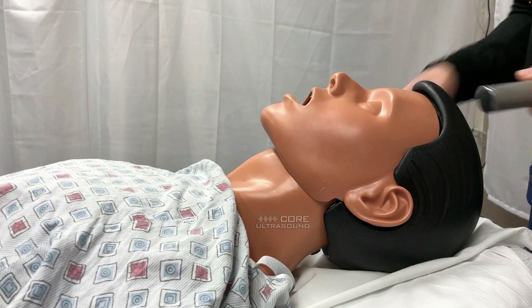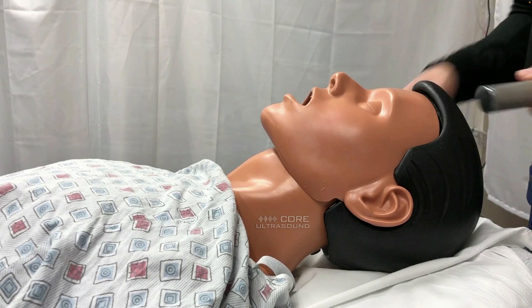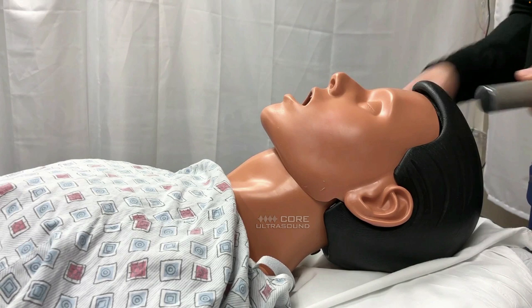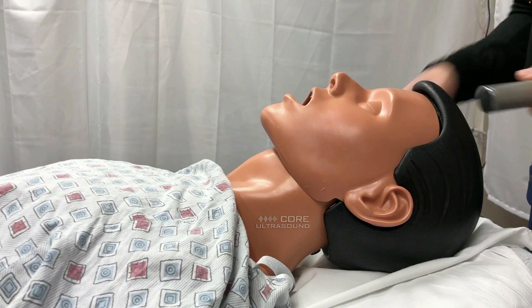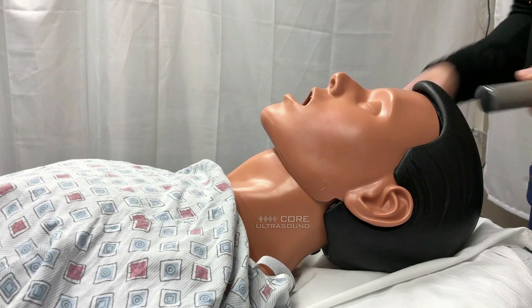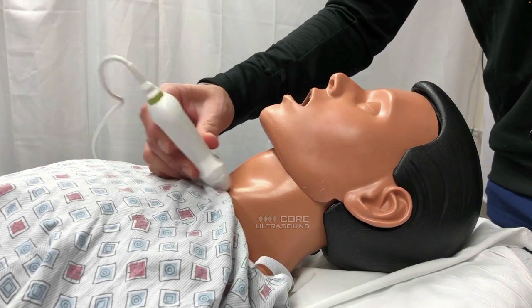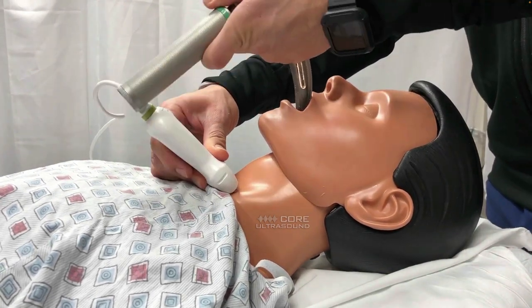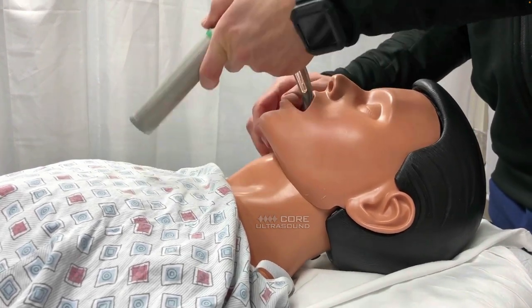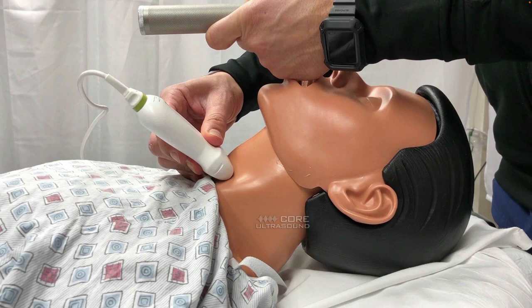Once you've done your survey scan, put the probe down and let the intubator place the laryngoscope in the mouth first. To do this dynamically, it actually is a two-person examination. With us two-handed people, we can only have the endotracheal tube in our right hand and the laryngoscope in our left hand - so we actually need a second operator to do the actual scanning of the neck. If you have the probe on the neck and try to stick the laryngoscope in, it just gets in the way. So go ahead and have your intubator put the laryngoscope in and then place the probe after that.